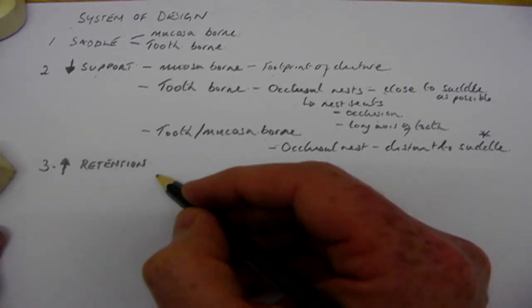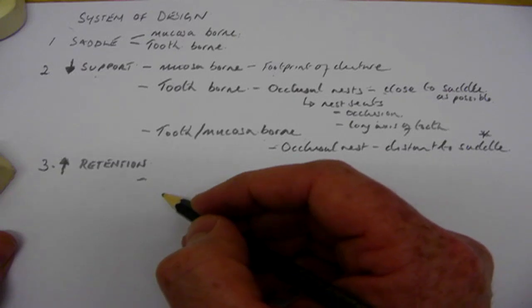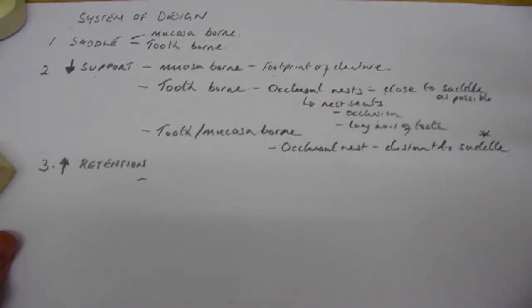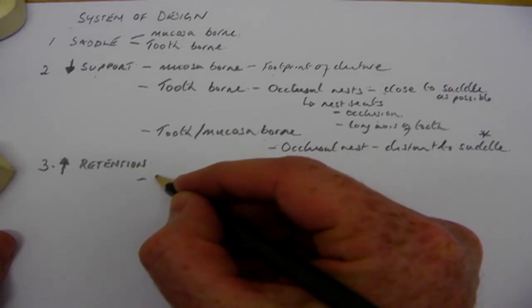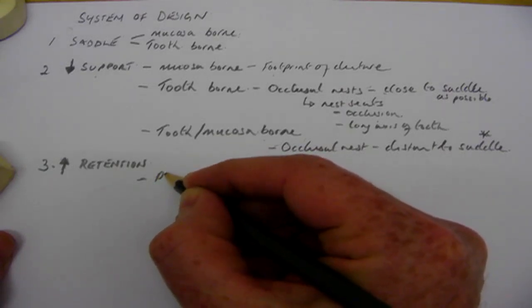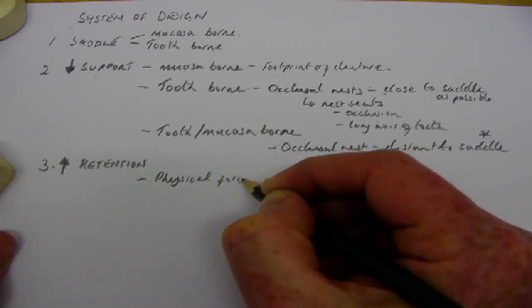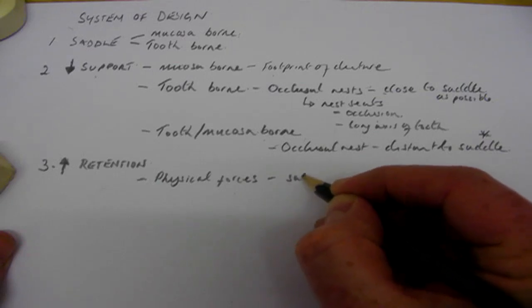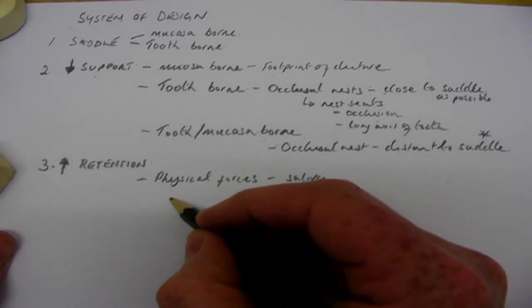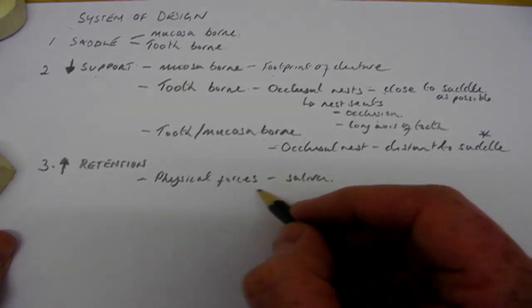Okay, now when we're providing retention, we automatically start thinking of clasping or creating a path of insertion that differs to the path of displacement, but don't forget we also get retention through the physical forces, so the adhesion and cohesion of the saliva and creating a peripheral seal to get some suction underneath the denture.